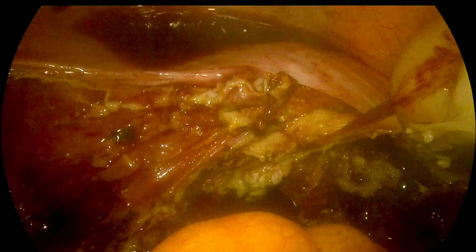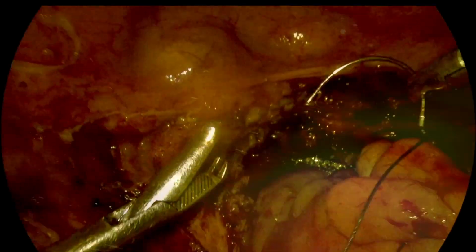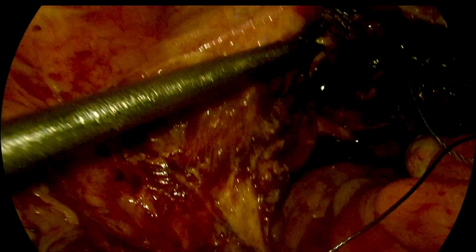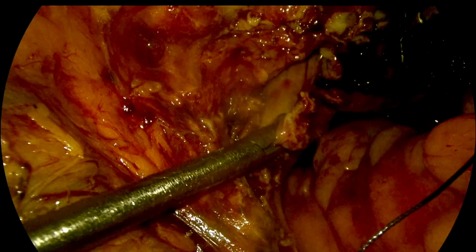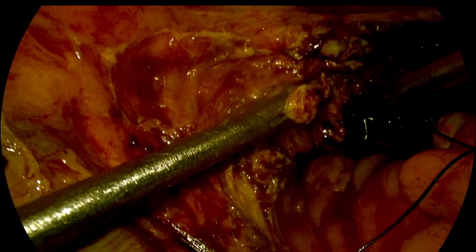So this is how the hysterectomy surgery is completed. Though the uterus size was small, just an 11 centimeter uterus with a fibroid, because of the previous surgery the anatomy was distorted. So we had to complete the dissection before we started doing the surgery.